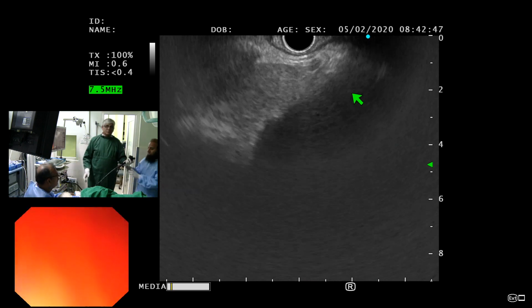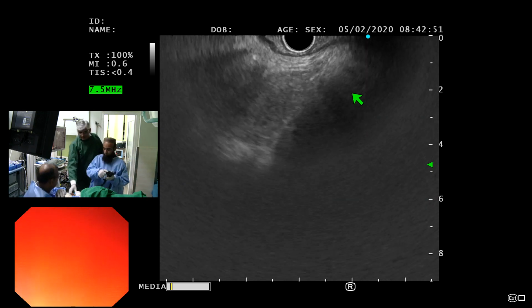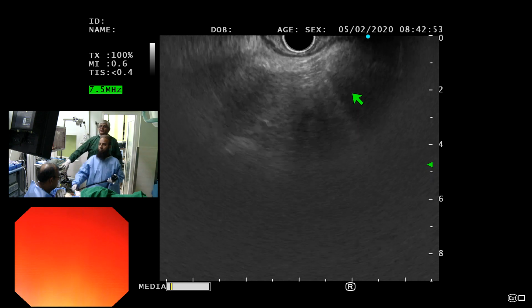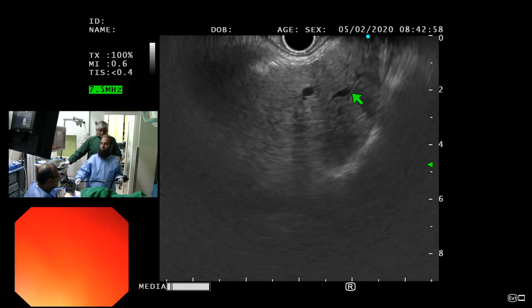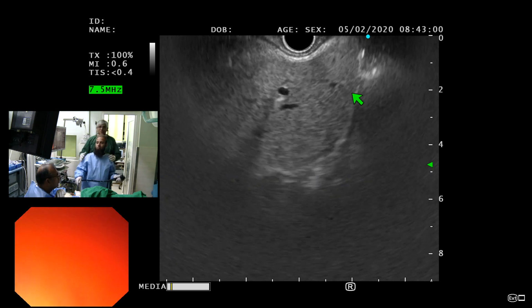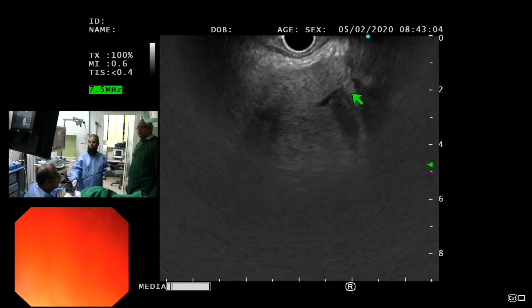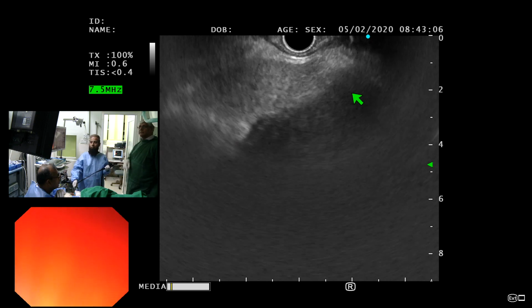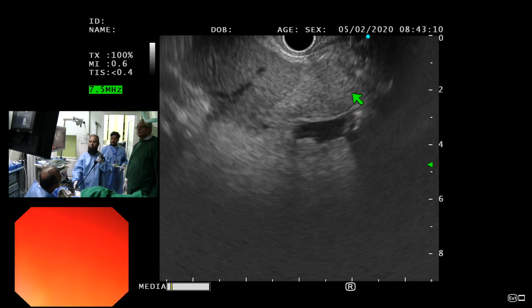So come back and show me the mediastinum now. Just practice the liver thing again. Lift your tip up, and I want your scope straight. So that means you need to stand back. I'm standing here. Now rotate. Yeah, just take this there, gently. We are done.